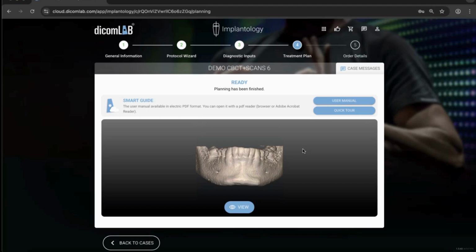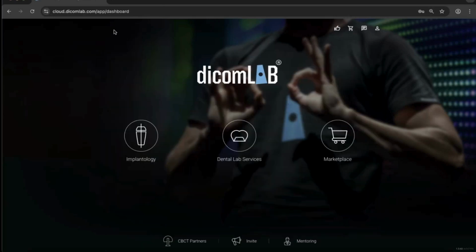We are very, very enthusiastic and happy to show it to you and to listen to your feedback. So from this moment, whatever you upload, it will open in your new software. If you have any questions, maybe check this video or check the video which is integrated at the software opening part, or also feel free to reach out to us, and we are super happy to help with any technical issues or questions. Thank you very much for your attention, and I'm also happy to gather all questions later and answer them to you personally.